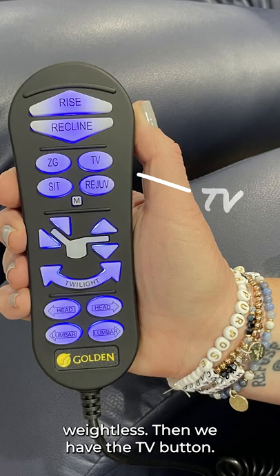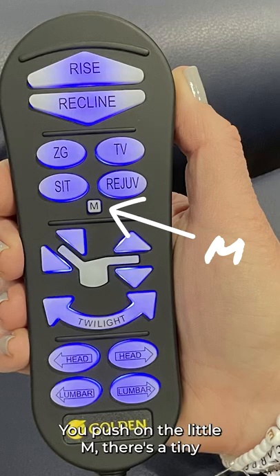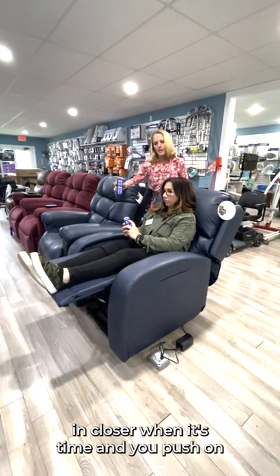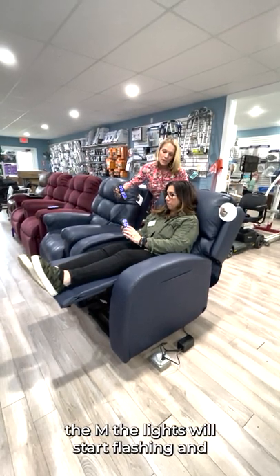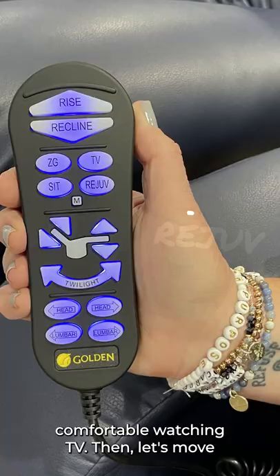Then we have the TV button, which is a programmable button. You push on the little M button here — the lights will start flashing — and then you set it to any position that you're comfortable watching TV.